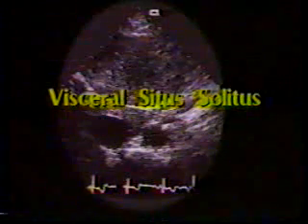The next step is to establish the visceral situs. A detailed ultrasonic evaluation of the viscera and great veins is essential for complete evaluation of complex lesions. It is best to start with the views of the upper abdomen and to identify the inferior vena cava and aorta utilizing the transverse as well as the longitudinal views. Note the normal side-by-side relationship of the aorta and inferior vena cava. The inferior vena cava is on the patient's right and the aorta to the patient's left.